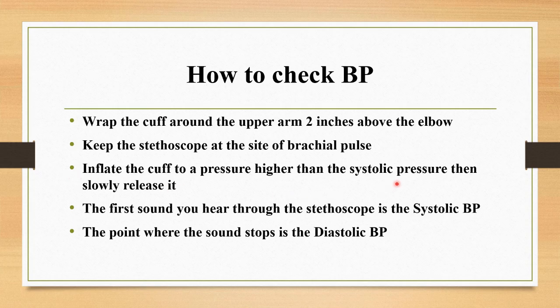How will you know that? For that, feel the radial pulse with one hand and start to inflate the cuff with the other hand. Inflate the cuff until you fail to feel the radial pulse. Then slowly release it. Simultaneously, note the readings in the manometer.